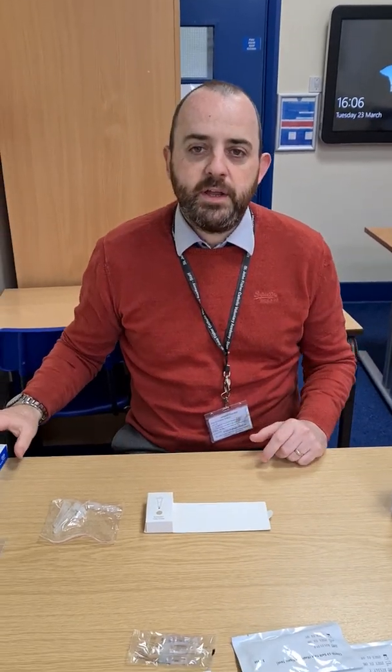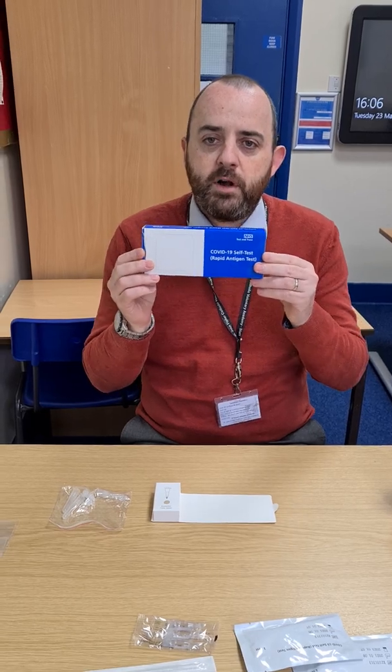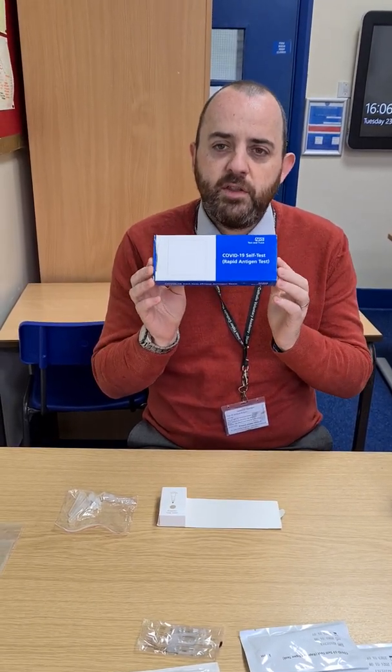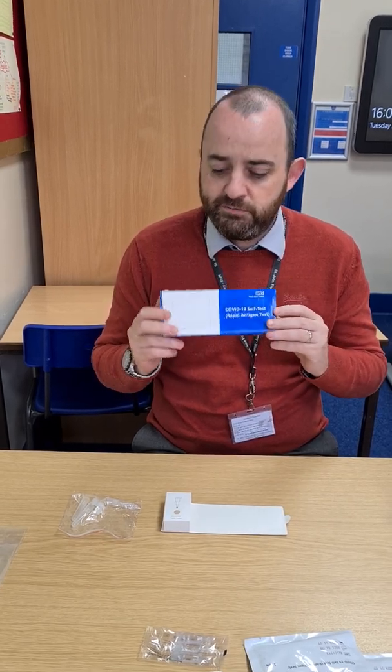Hi there. I'm going to show you how to complete your lateral flow test at home. Your lateral flow test will come in a box like this, and each box contains enough for three tests. Initially you'll receive two boxes, so you have enough for three weeks.